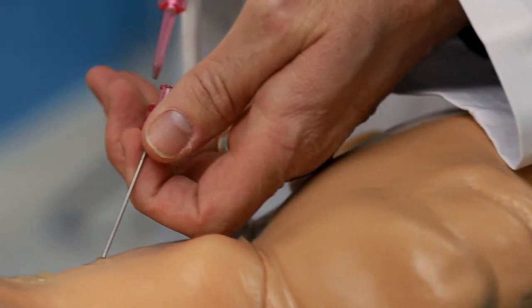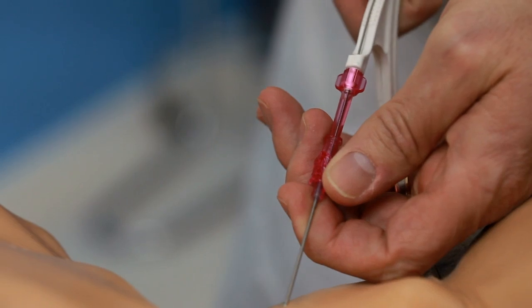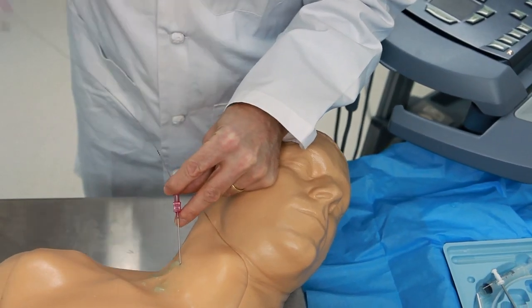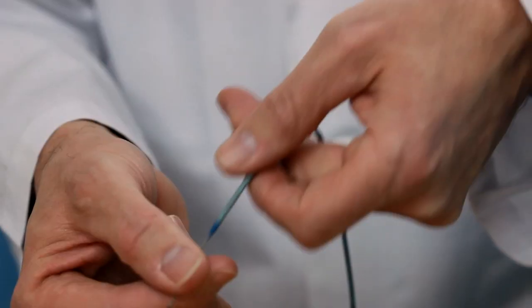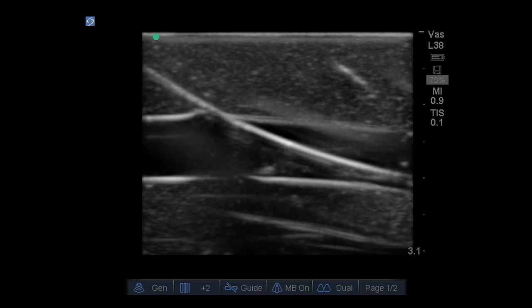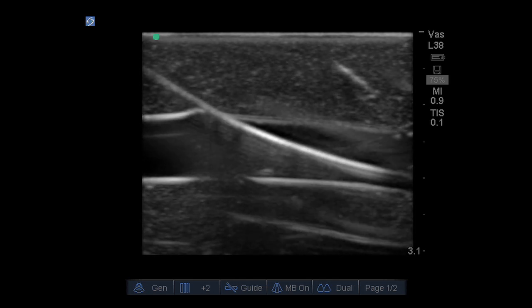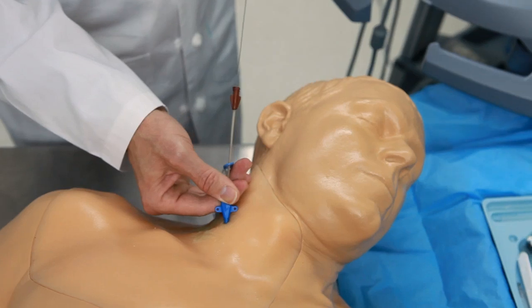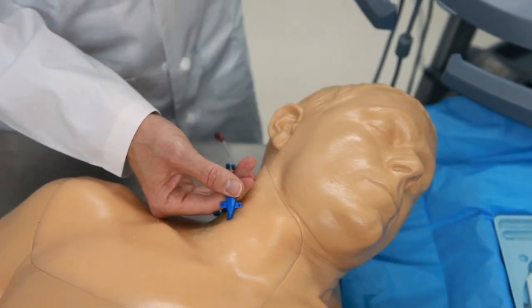Some of the best feedback we get from our customers is how durable our products are. They're always amazed with how many uses they can get out of our tissue. We introduced our central line models in 2003 — almost nine years ago — and we're still hearing from customers who are using them today, despite being used thousands of times to place needles, guide wires, and catheters. There's no other material anywhere that comes close to matching our durability.